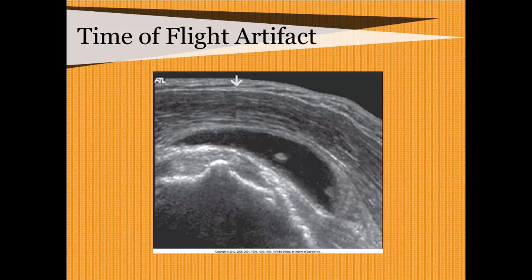So here you have an example. It's fat, skin, muscle, and you've got the speed of sound artifact, so it's not returning at the same speed.